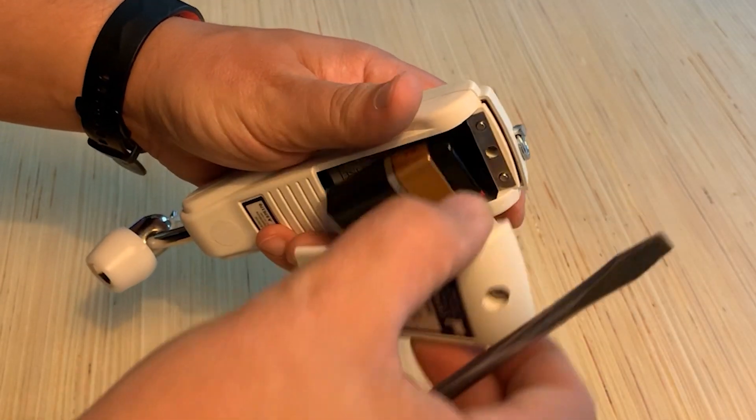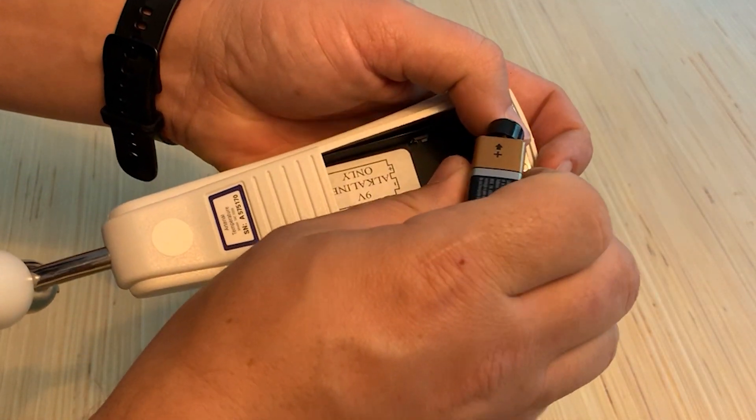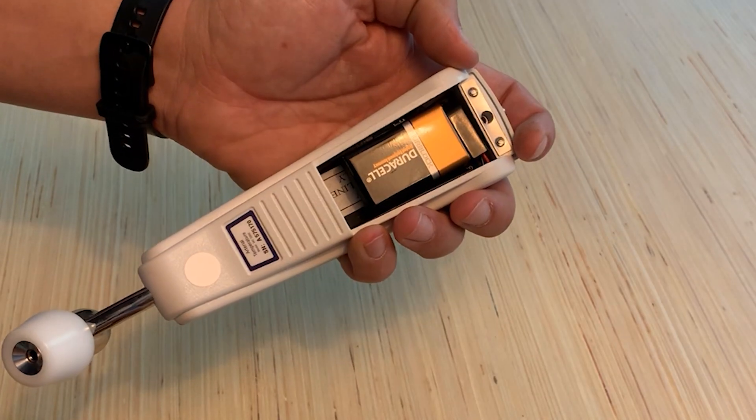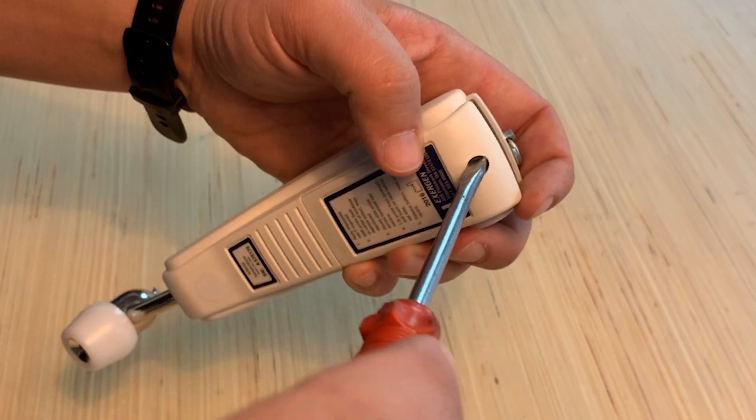To change the batteries, simply remove the screw in the back of the thermometer and replace the 9-volt battery. Replacement batteries can be ordered during your routine EMS supply order.